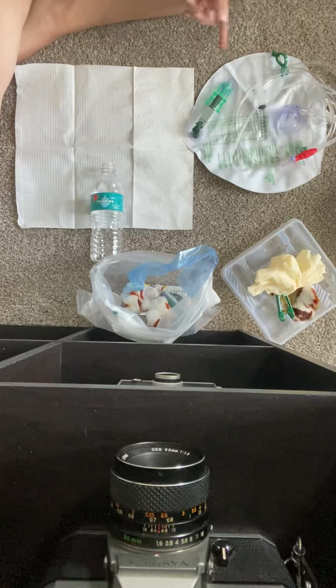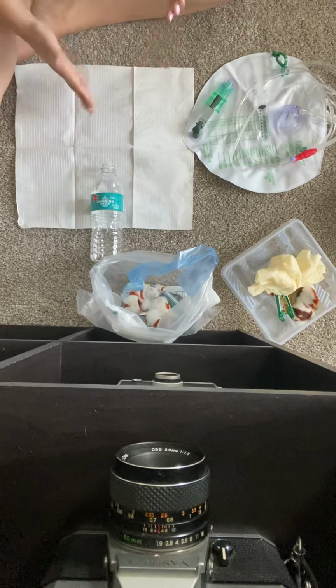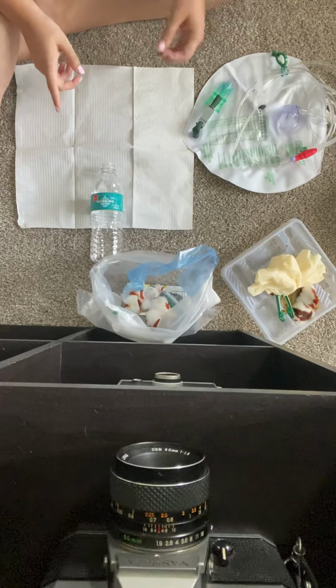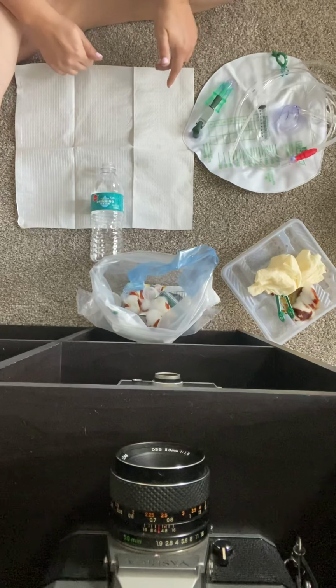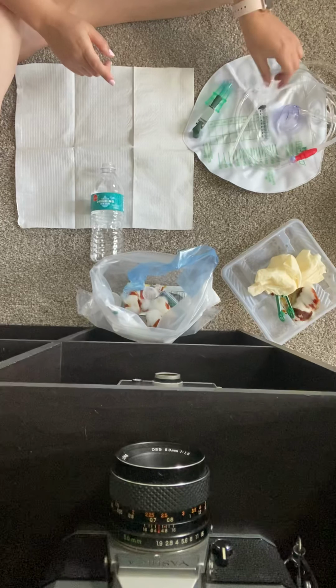So then after that, like I said, you want to document what size French you did. We inserted a 14 French. And then what today is, so usually they do time and date. You just plug those in, plug in what French you did. We did sterile technique when we did it. And then amount, usually it'll say the amount you filled it with.